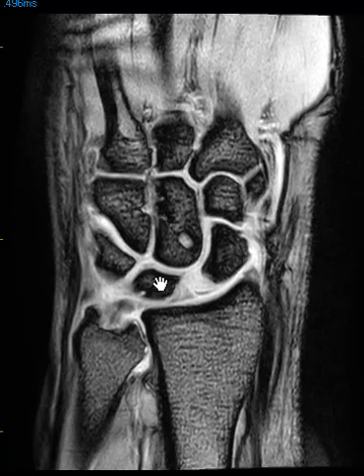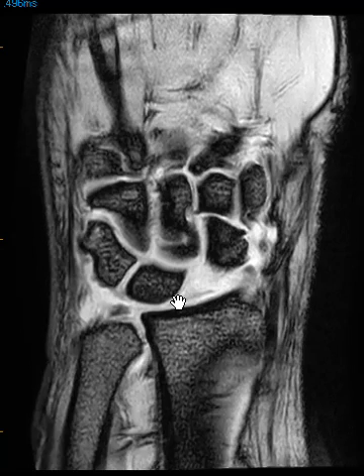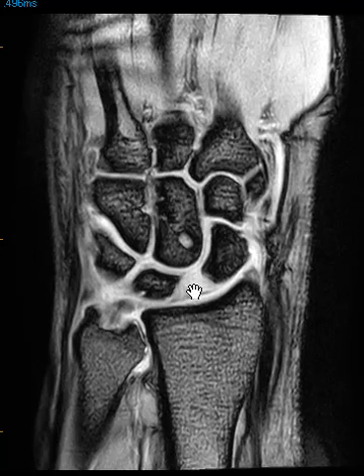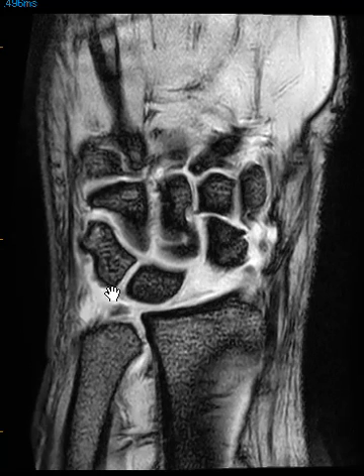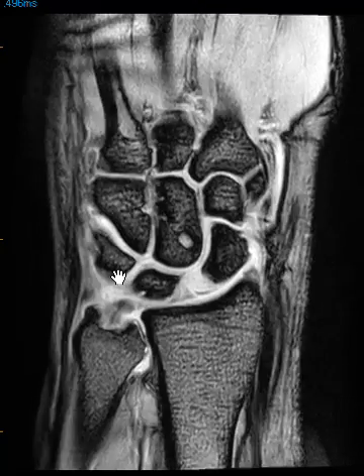The scapholunate ligament, which comes along the undersurface here, is torn, and it allows for this interspace to widen. When this happens, the capitate bone can migrate proximally down through this and push these out of the way, causing abnormal position and rotation of the scaphoid and lunate bones. We'll also look over here for the lunotriquetral ligament, which is along the bottom here — that looks like it's intact, a normal relationship here.